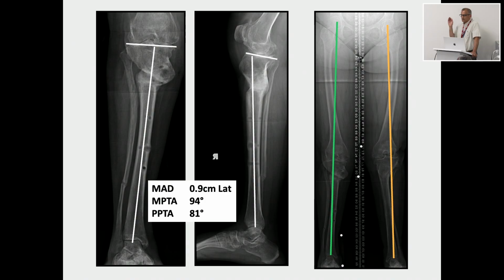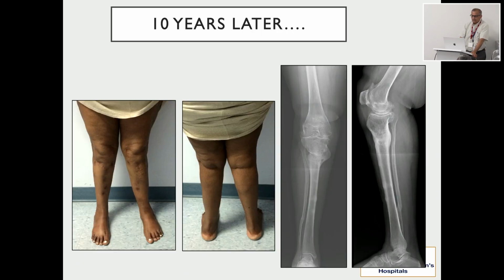You could see how much lateral translation was needed just to get the proximal tibial plateau and the tibial shaft in one line, right? So this was uncovering all the iatrogenic deformities that were there before, when they were just treating angulation without translation. And so she was like 10 years out, and now she was happy, she actually didn't need a total knee. The last I saw her was 15 years post-op.